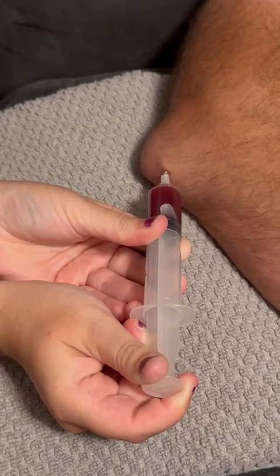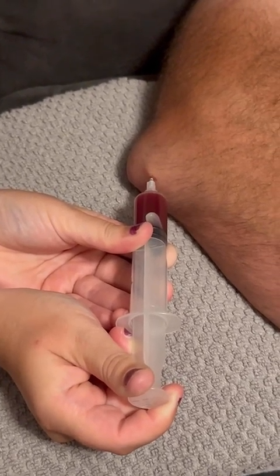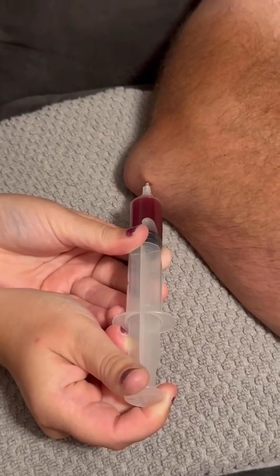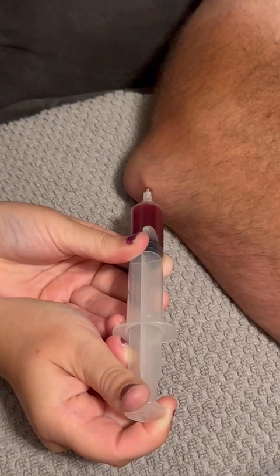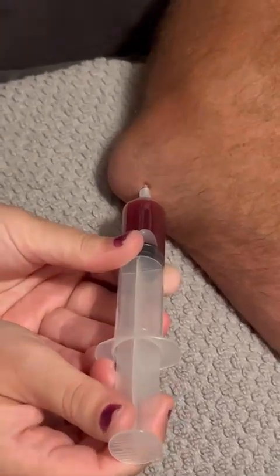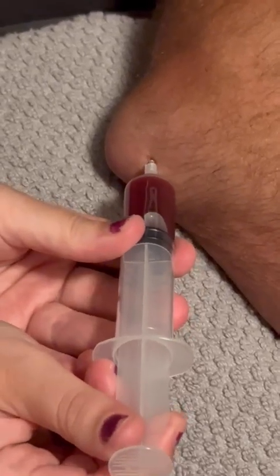It's funny, because while recording you can see your elbow shrinking. Seriously? Yeah, heck yeah. There you go. You're kind of pulling on that needle. It hurts a little bit. Just be gentle.